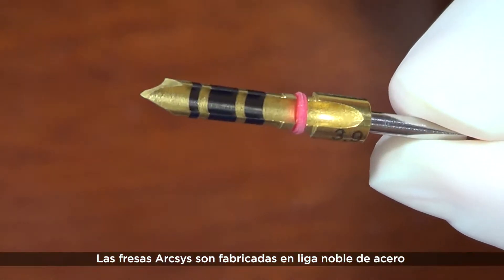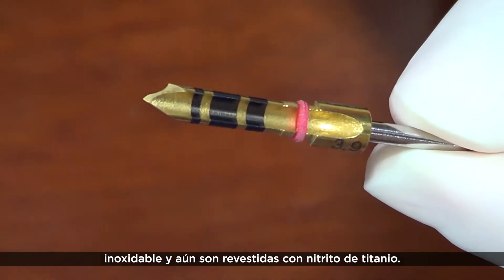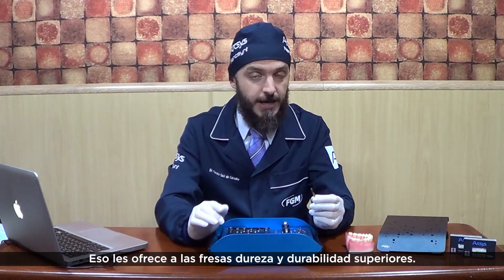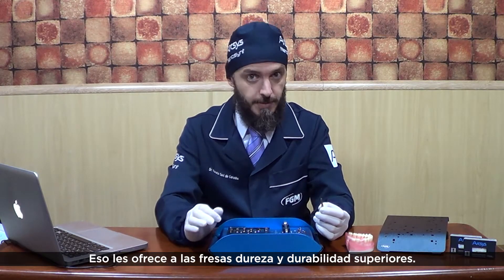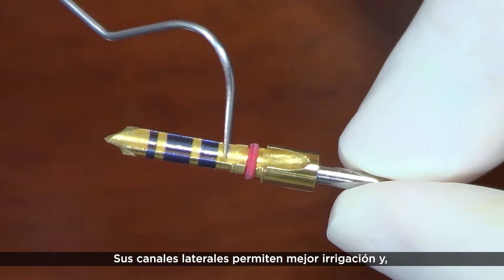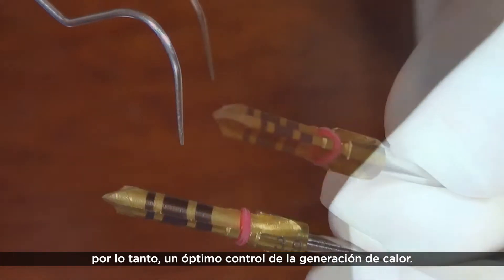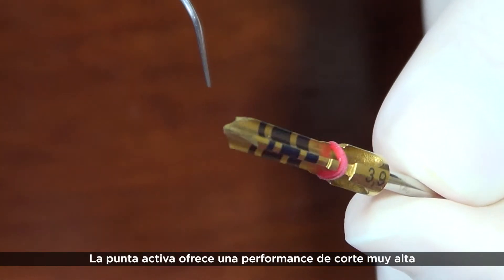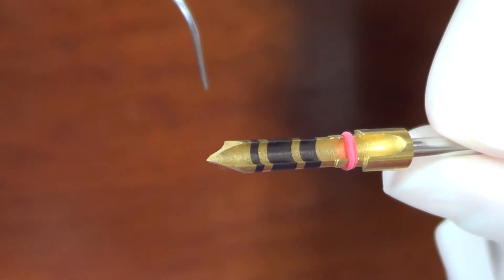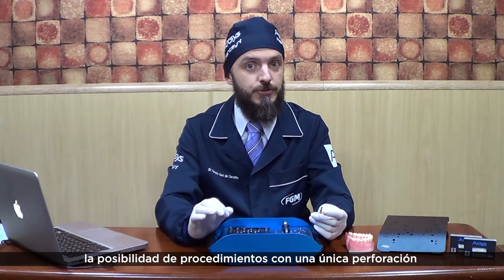The Arxis drills are manufactured in noble stainless steel alloy. Moreover, they are coated by titanium nitride, which provides them superior hardness and durability. Their lateral channels allow improved irrigation and therefore optimal heat generation control. The active tip presents high cutting performance, which gives them a singular feature.